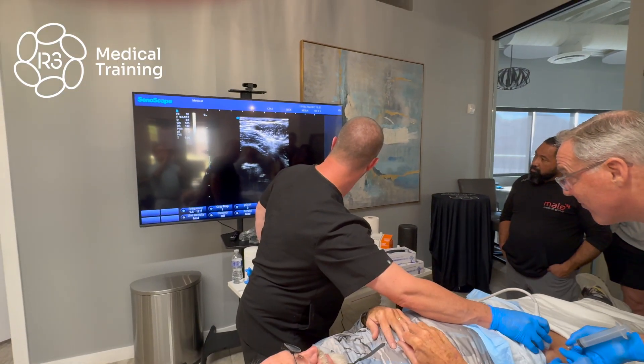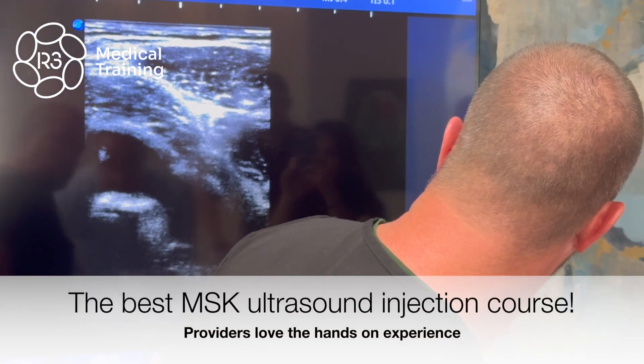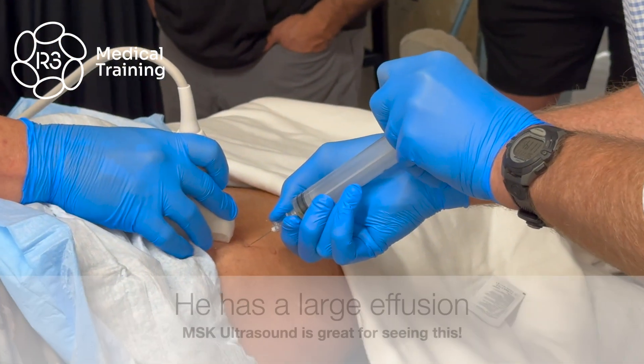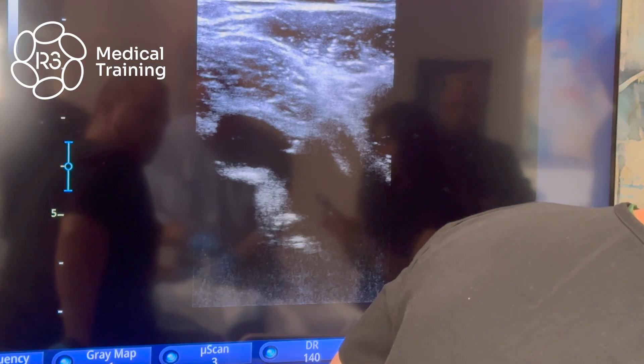Can you guys see the tip of the needle? Advance — advance a little further, keep going. You've got a bougie — there you go, now you're in it. That's great. Very cool, good.